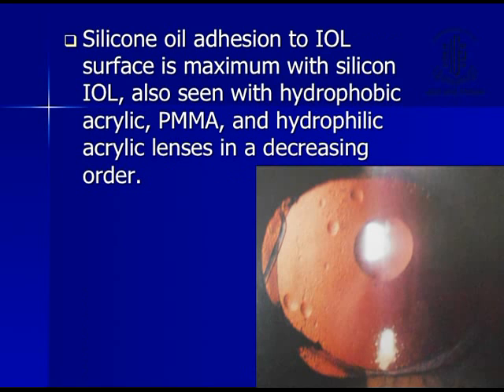Now here this is silicone oil which is adhered to the posterior surface of silicone IOL. Oil removal has already been done in this eye.